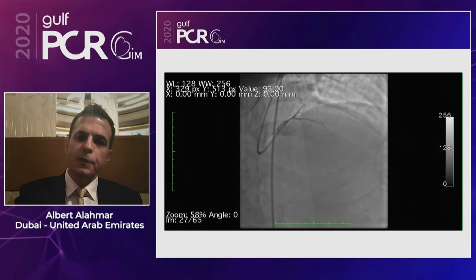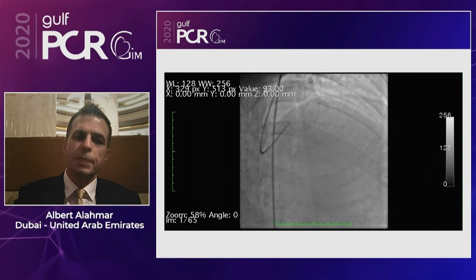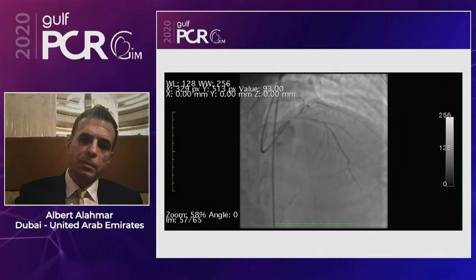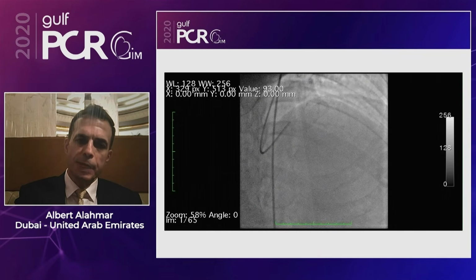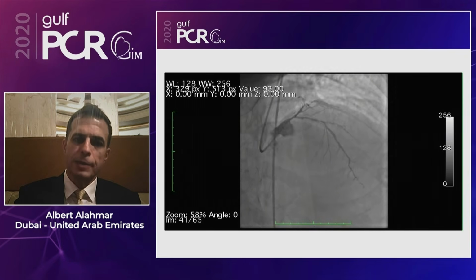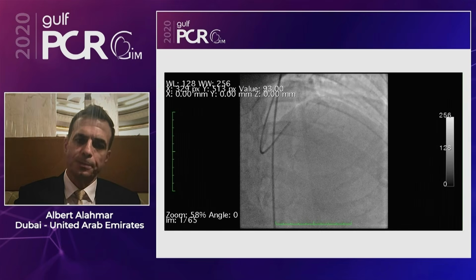The left system, his left main stem, his LAD and circumflex, they look really abysmal. Heavily calcified, extensive disease, including the distal left main and an occluded CTO of his obtuse marginal. So my plan was to address his left main stem and his LAD using orbital atherectomy, and then address his circumflex at a later stage, given the circumflex is a small non-dominant vessel.